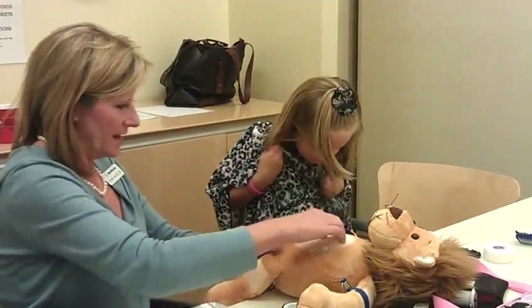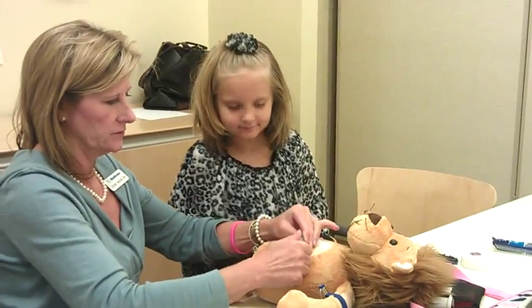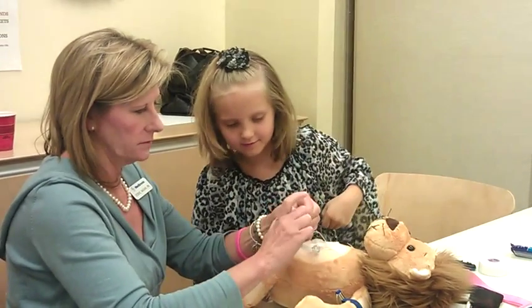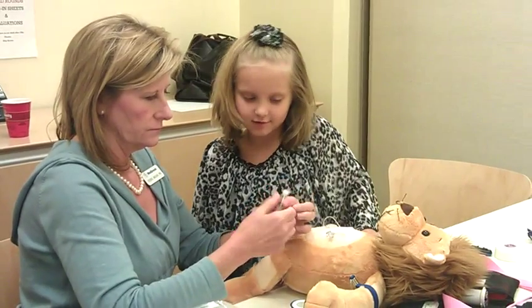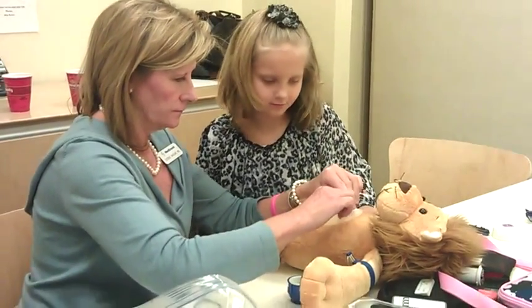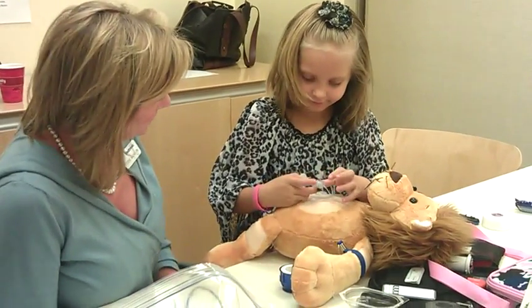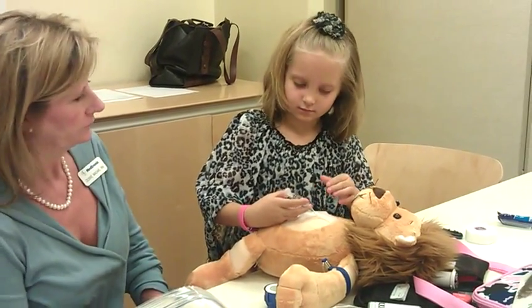It's so cute. How's that? You guys match. Let me see if I can release the air. I'm going to learn how to give him some insulin — pretending to give him some insulin for real. That's going to be fun. So you check his blood sugar when you check yours. And we're ready to check your blood sugar. Are you ready? They just checked it. We need to give a — we need to give a.